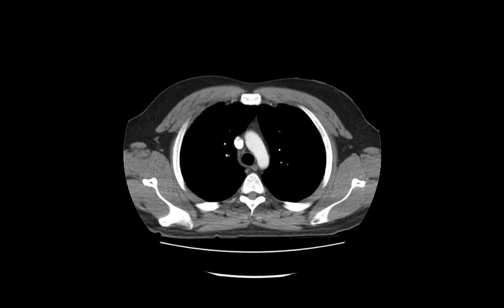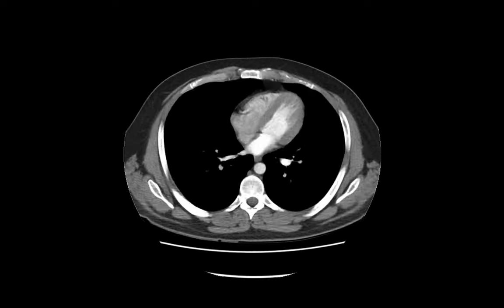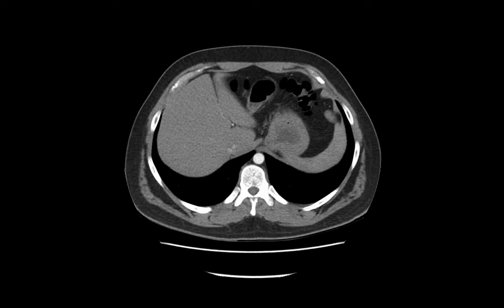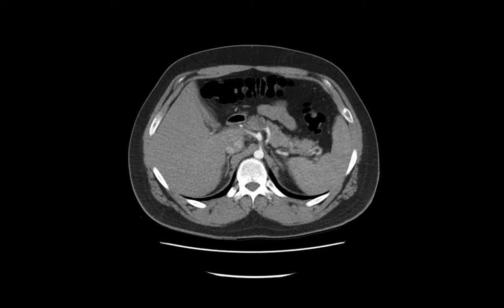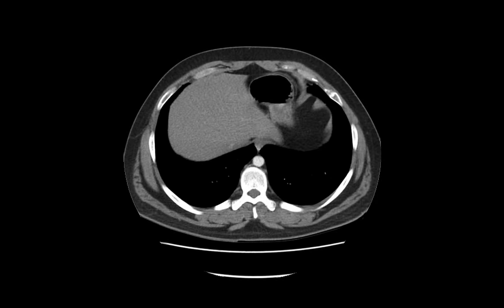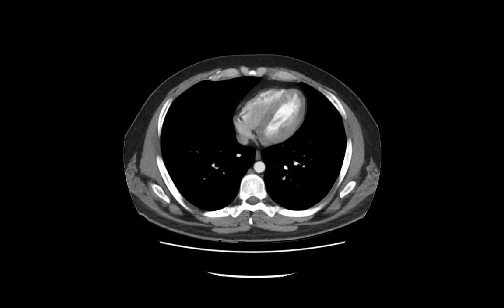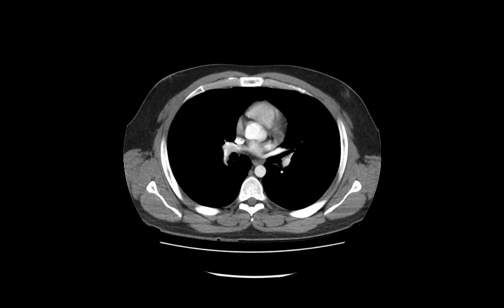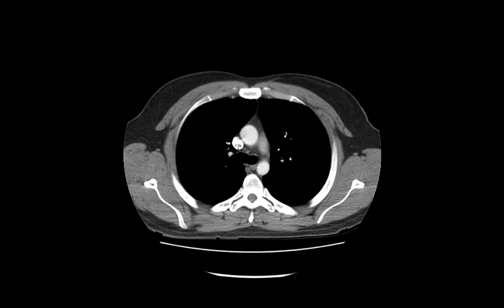We're going to do thoracic axial CT scans. We're going to scroll down from the neck all the way into the abdominal cavity, and then scroll all the way back up as well. Let's talk about this anatomy.